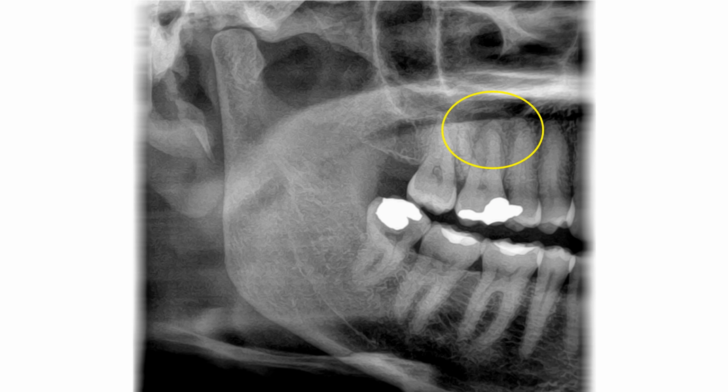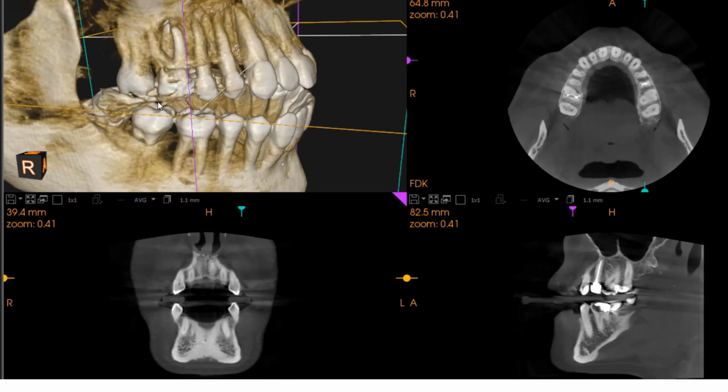For example, in such a case, a maxillary first molar was presented to me, and this not very clear picture made me feel not very happy. I wanted to analyze the area before I start my treatment.